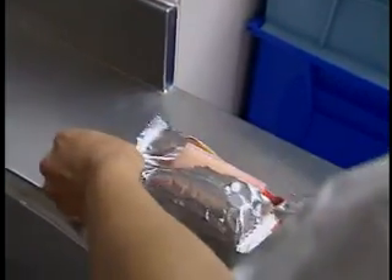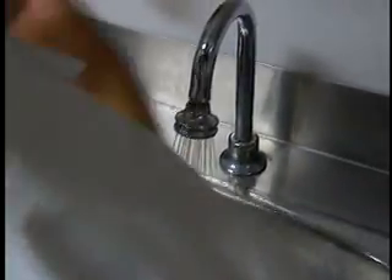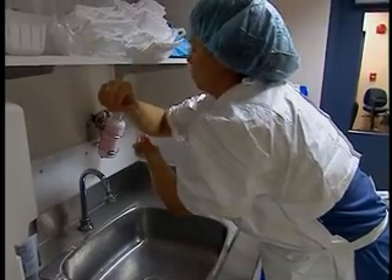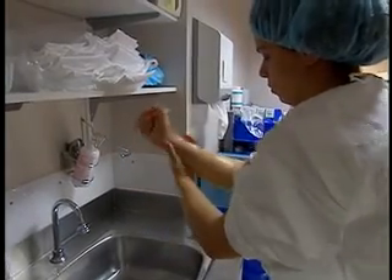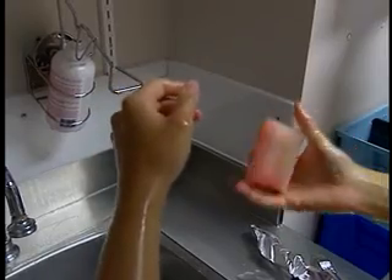Begin by removing the outer wrapping of a nail brush. Wet your hands and forearms with warm water to about 5 cm from your elbow, but without wetting the cuffs of your gown. Use the antiseptic soap dispenser and spread about 5 ml of soap on your hands and forearms. Carefully scrub the top of your nails as well as underneath and around them with the soapy nail brush.